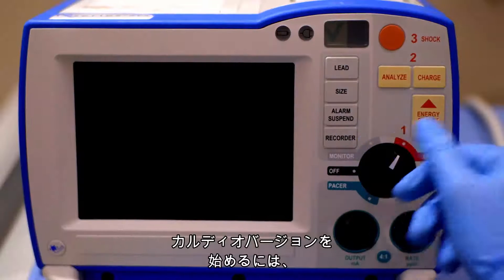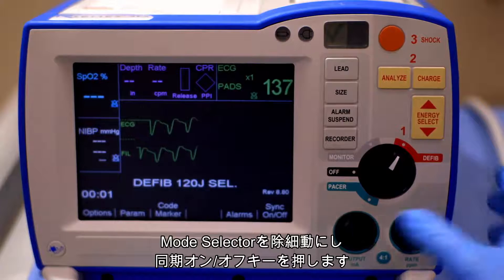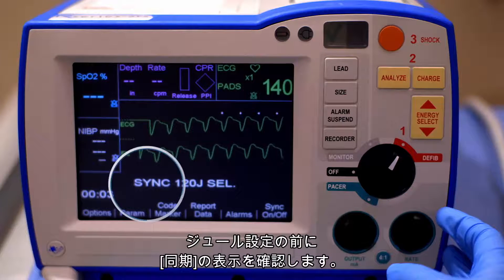To begin cardioversion, turn the mode selector to D-Fib. Next, press the SYNC ON-OFF softkey. Verify that you see the word SYNC before the Joules setting.